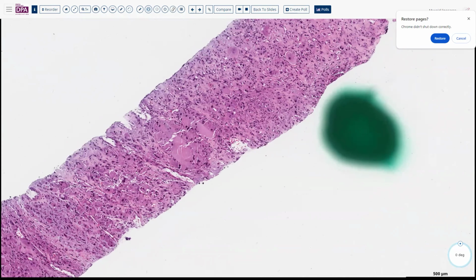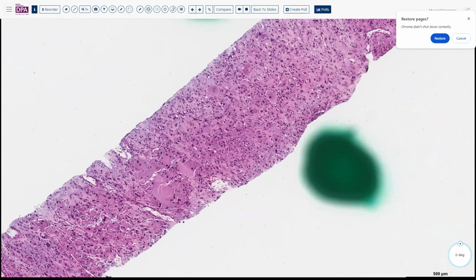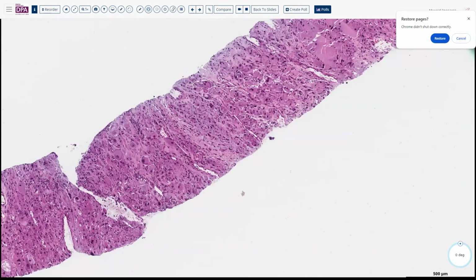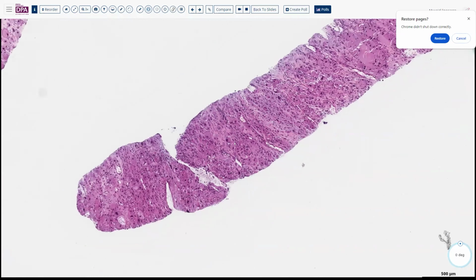But that would put this into the category of a myxoid liposarcoma. The DDIT3 FUS fusion gene is quite characteristic and diagnostic for that entity. So rather than being left with just high-grade sarcoma, we were able to say, high-grade sarcoma with at least some backdrop in the myxoid liposarcoma category.